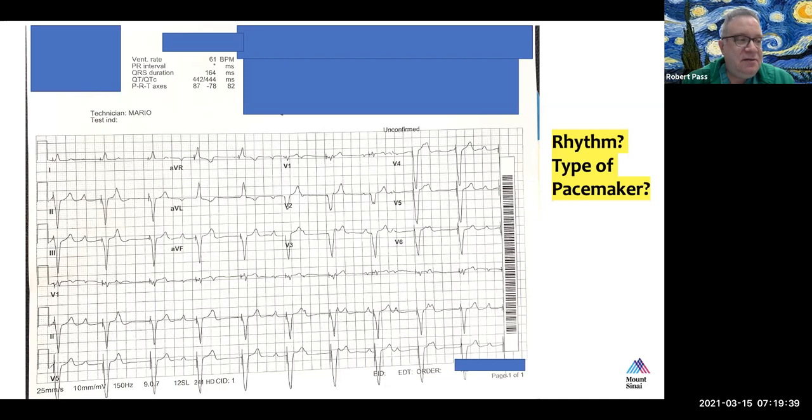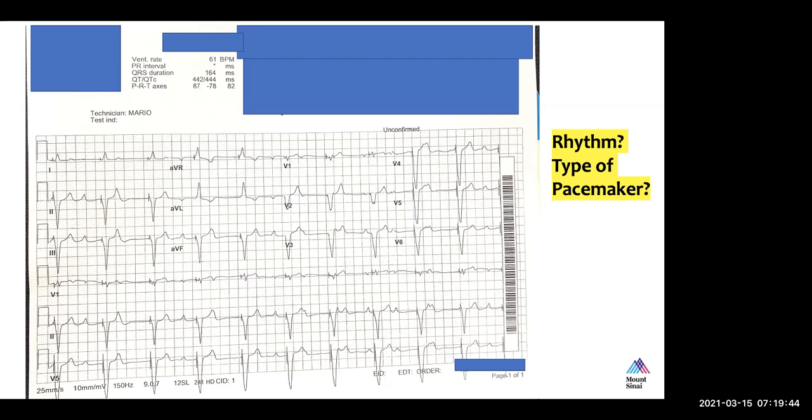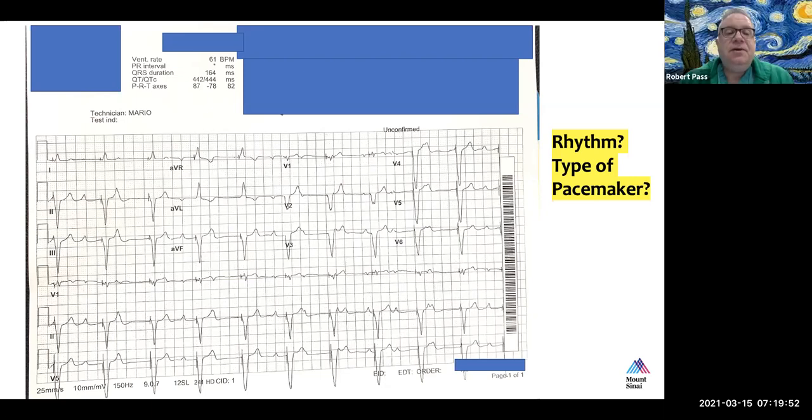What about valve regurgitation? Oh yes, the valve regurgitation would be less with sensed V pacing, like dual chamber. Right, because again, there would be AV synchrony. So AV synchrony is very important in somebody who has AV valve regurgitation. And then the third reason that it might be useful is in a patient who has a single ventricle, because we know that in general, mortality and survival is worse in VVI paced single ventricle patients.